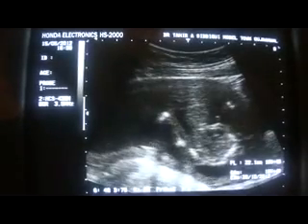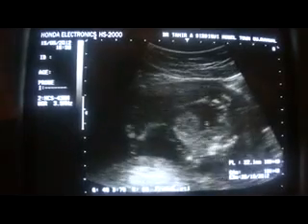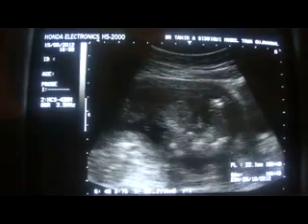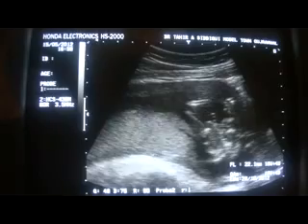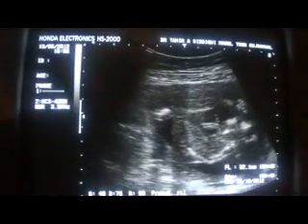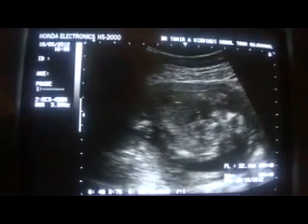This is the urinary bladder. This is the amniotic fluid. This is the uterus. This is the fetus. So the placenta is posterior wall, grade 2. There is no evidence of any placental anomaly.